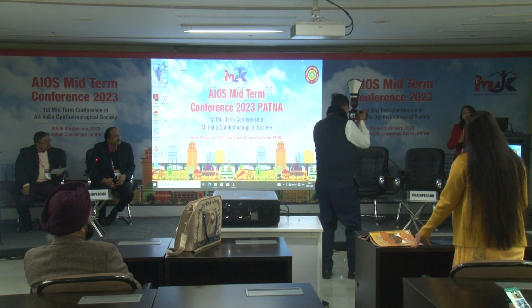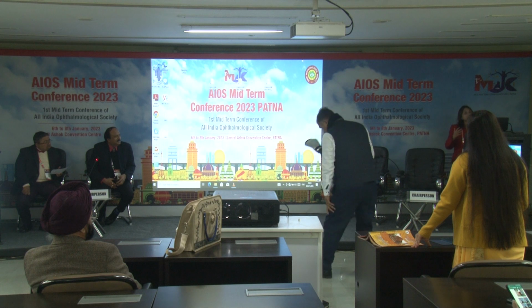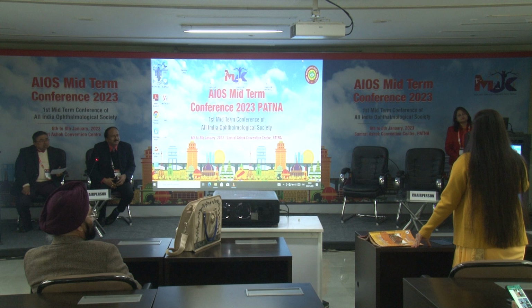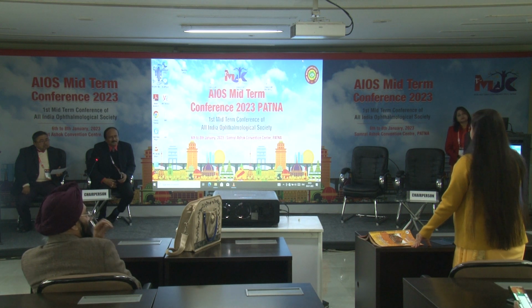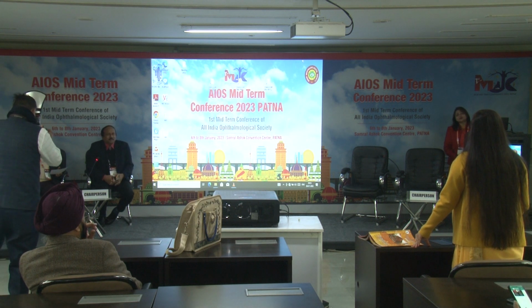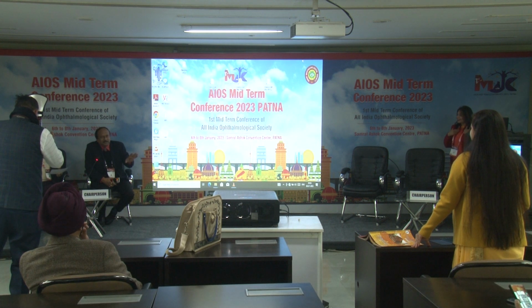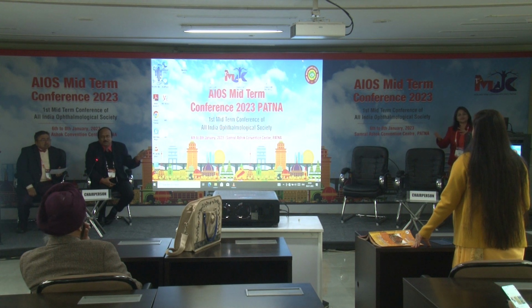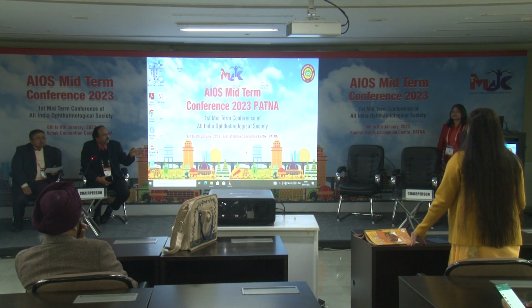See, 4.5 was my maximum spherical equivalent. But she was accepting something like 3, 2.5 because she was myopic. She was happy also. The piggyback lens is going to depend on the post-operative manifest refraction, whether you did an IOL exchange or put a piggyback. I did not have the guts to do an IOL exchange in that high myope. There was a change in refraction from the first week to the final, so she waited for stabilization of refraction. That is the reason.